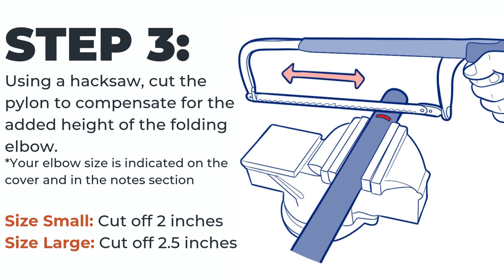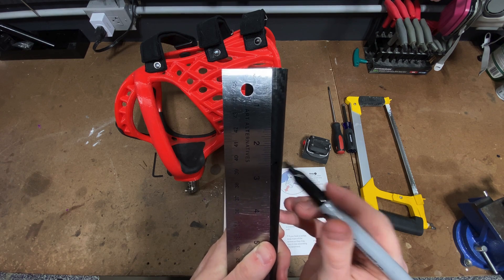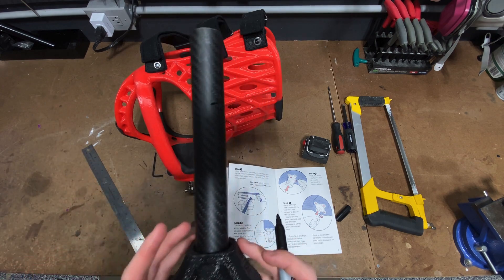Step three: using a hacksaw, cut the pylon to compensate for the added height of the folding elbow. If you are unsure of your elbow size, you can find it on the cover and in the notes section of your instruction manual. For our size small, you will cut off two inches, and for our size large, you will cut off two and a half inches.